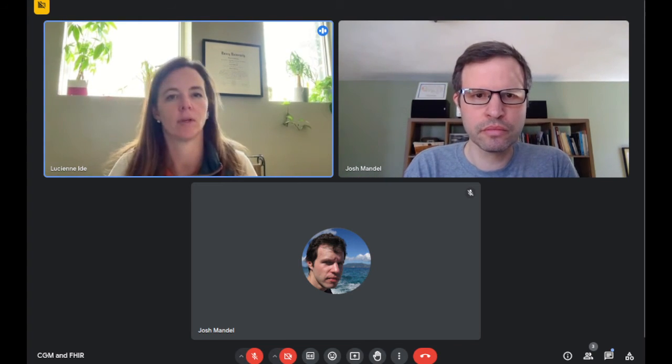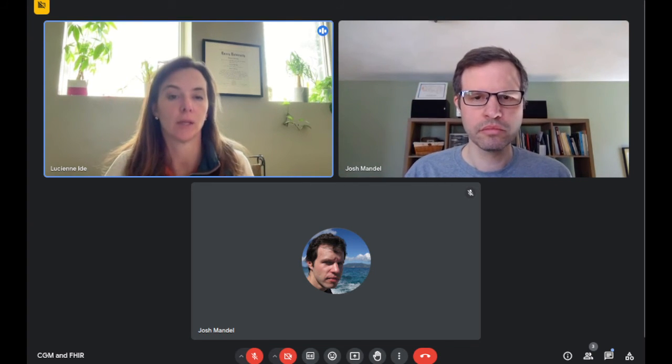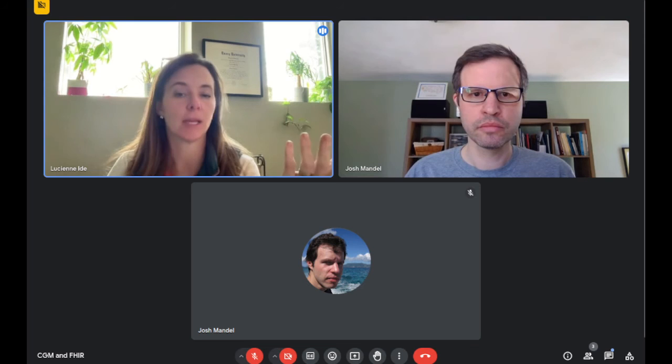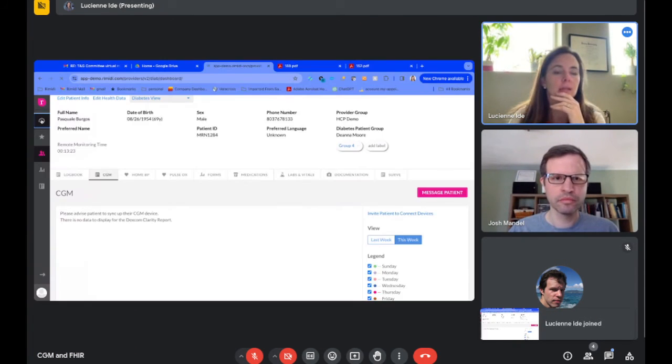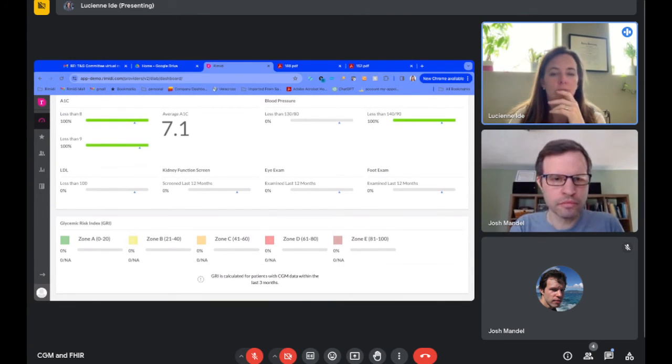Let me reshare my screen. So we're calculating GRI based on that time and range data. And it's debatable, right, what's ultimately going to be that quality measure that gets written into different plans and things. So here's GRI, and it is categorized zone A to zone E. It's a score of 0 to 100.